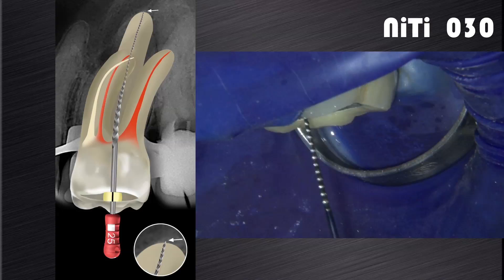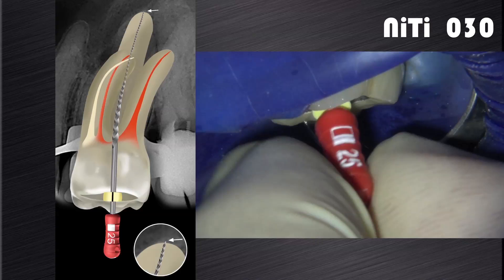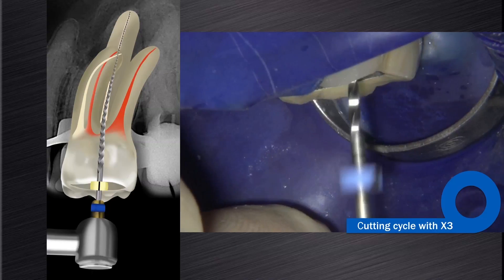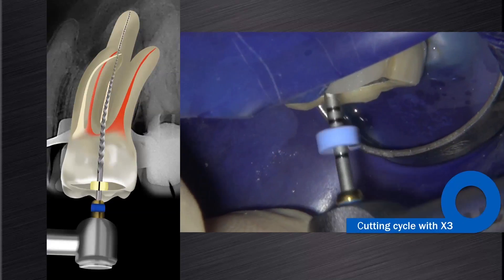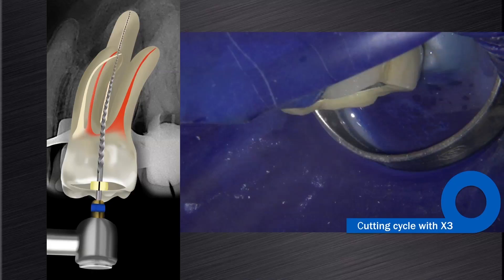If the size 25 hand file is loose at length and can go past working length, it is recommended to continue shaping with larger instruments. In this case, we elected to continue shaping with the ProTaperNext X3 (3007), and when necessary, you can follow up with the ProTaperNext X4 (4006) or the X5 (5006), gauging after each instrument with a size 30, 40, or 50 NiTi hand file respectively.